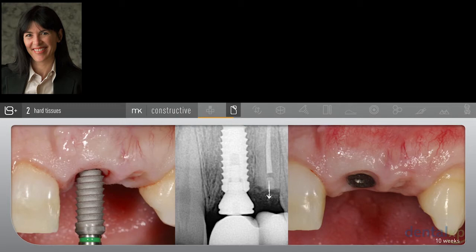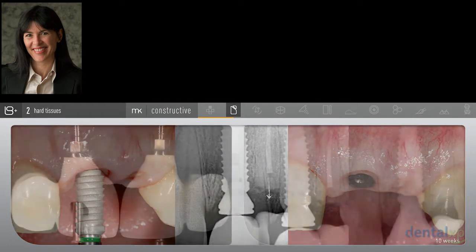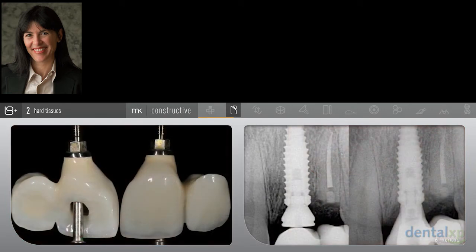So, carefully using a surgical guide, place an implant. I'm using an implant which has excellent primary stability. I'm looking for implants that give me super soft tissue and hard tissue stability at the crest. Those are my keys today. And then I ultimately move on to transitioning the patient and developing tissue architecture with the provisional restoration.